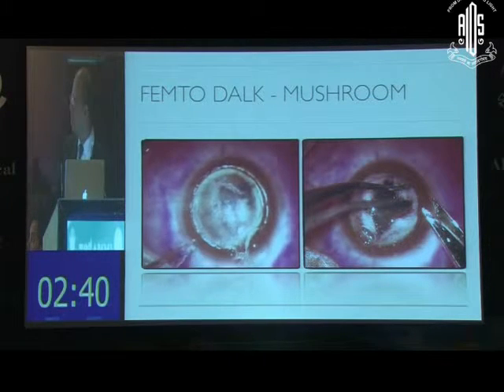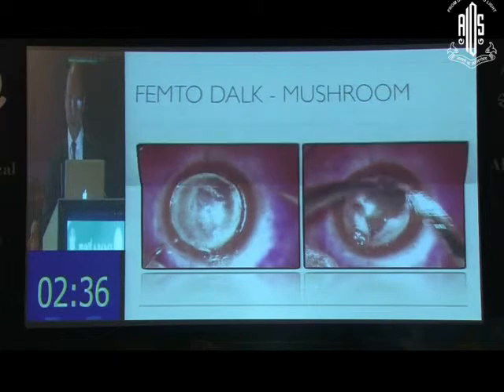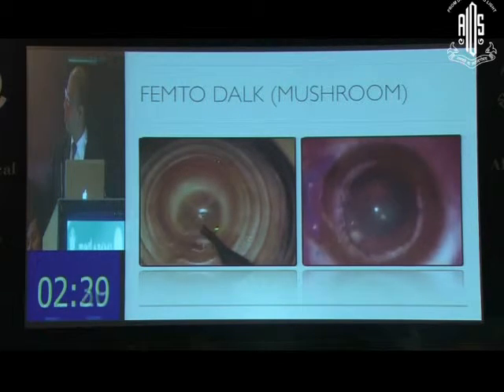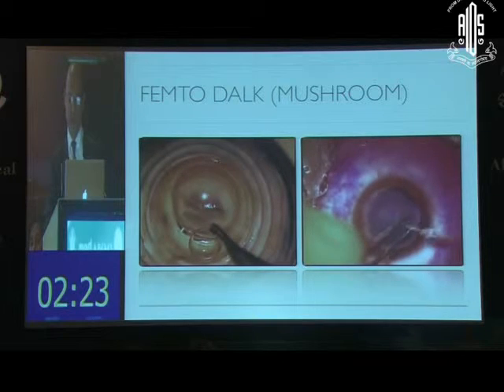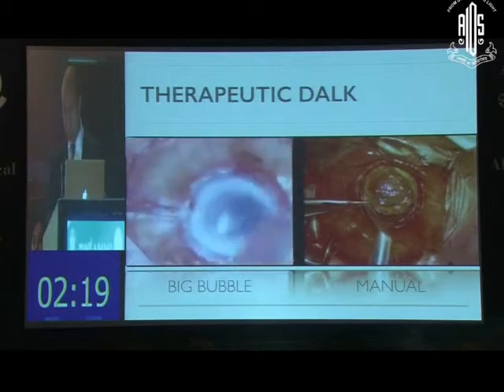And then of course you remove your quadrants, as was shown very elegantly by Dr. Vanti. Rest of it is quite simple. You just mount your donor cornea on an artificial anterior chamber and take it off, and you get the same mushroom cut. Take off the Descemet's and put the donor bed and recipient bed together and suture it.